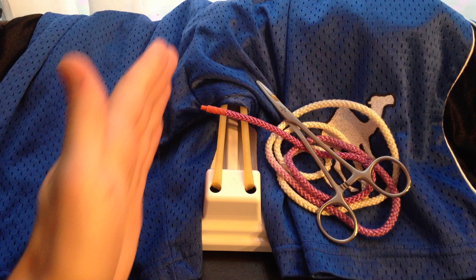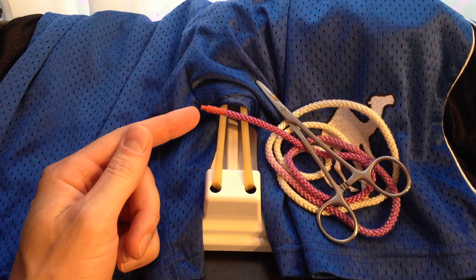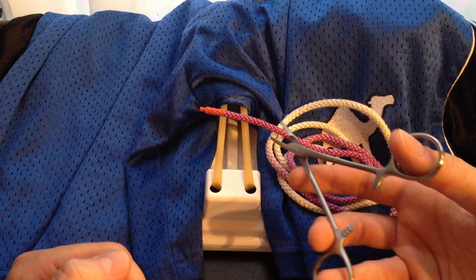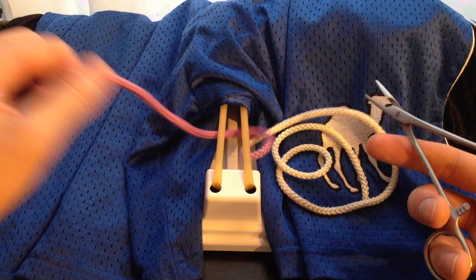To start, we've got our incision pointing away from us, and as always, the needle is attached to the purple string. You're going to pick up your needle driver, and the proper way to hold this is with your thumb and your ring finger. You can use your pointer finger near the top to give you some more control.